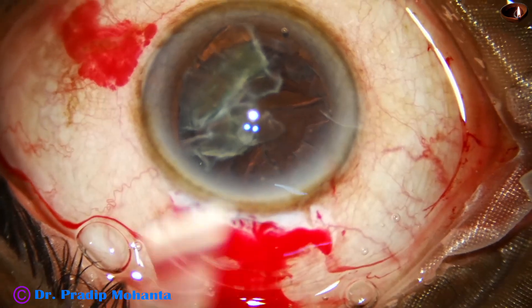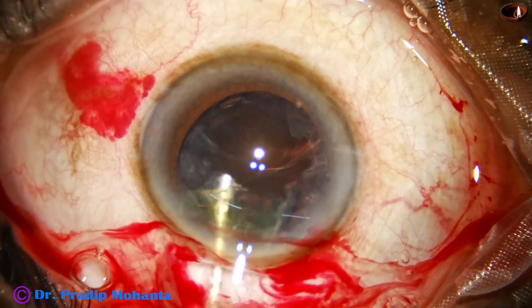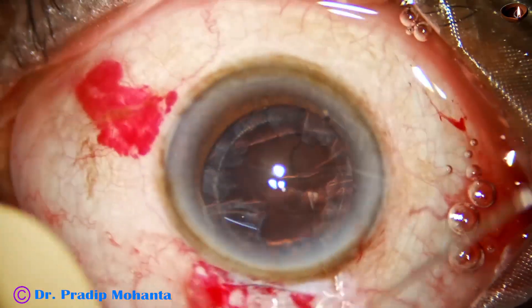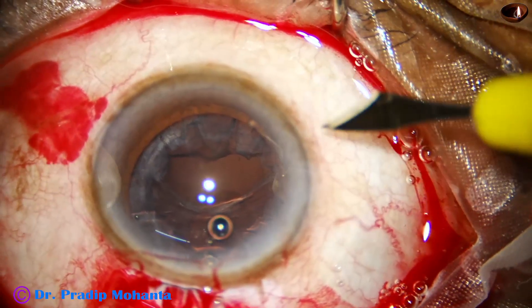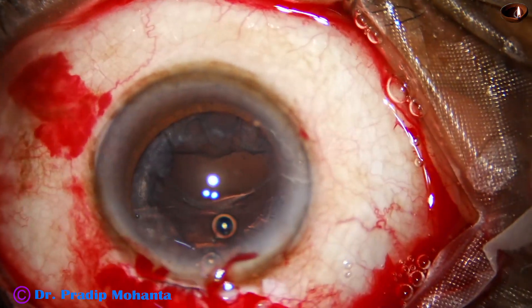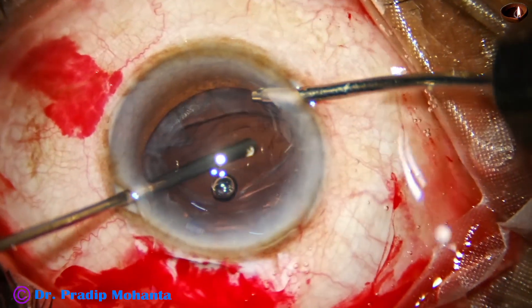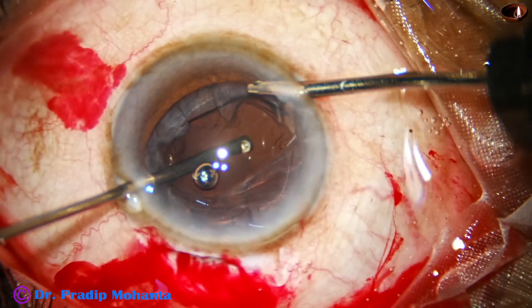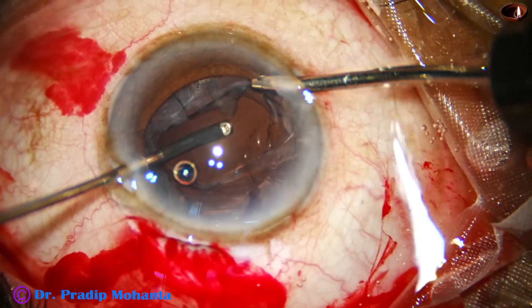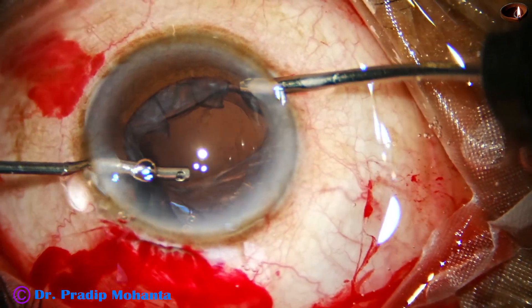By visco expression I remove the nuclear piece. Now I have to make another sideport for anterior vitrectomy. In this case I am planning limbal vitrectomy, not going through the pars plana.